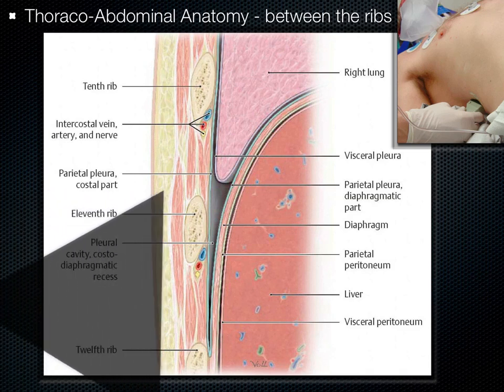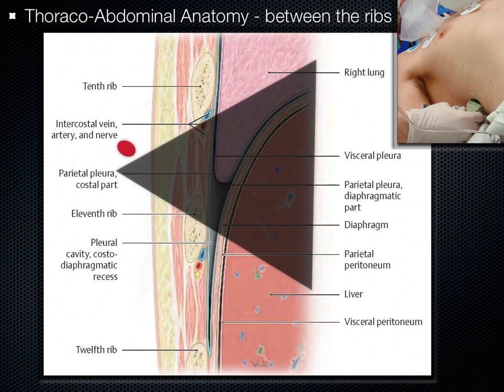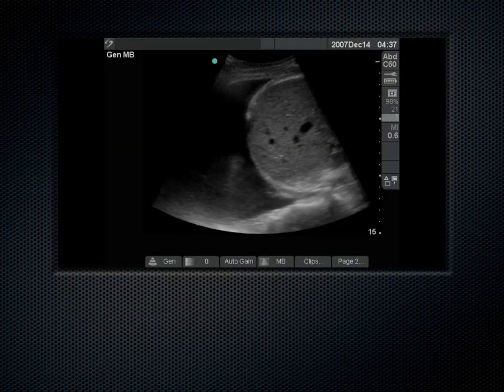So this is the spot where we just were, and you never quite can tell where a patient's diaphragm is until you look. For instance, our COPD patients, their diaphragms can be quite low. Our atelectatic patients, their diaphragms can be almost all the way in their axilla, so you just have to start where you think it might be and then move up and down until you find that interface where you're getting in one picture both the thoracic and the abdominal compartments, separated by the diaphragm.